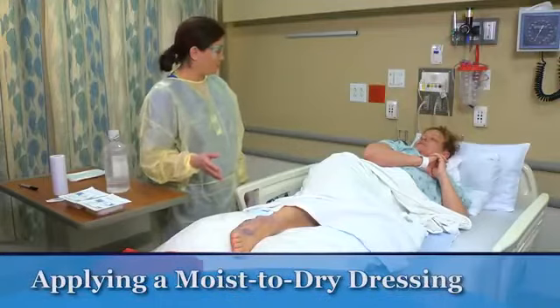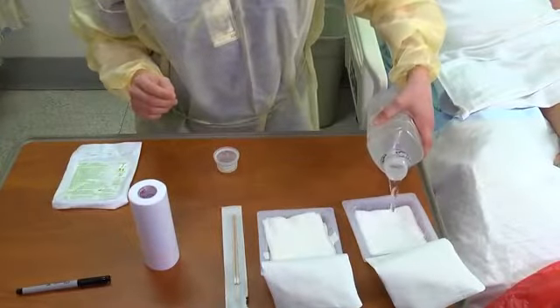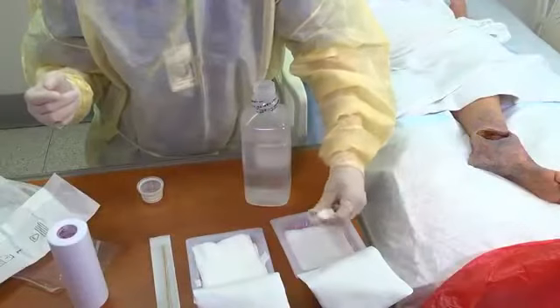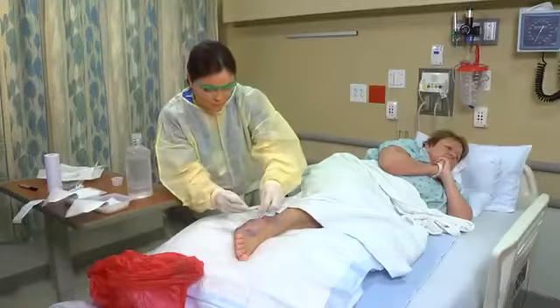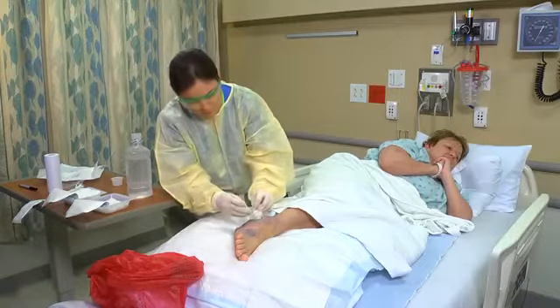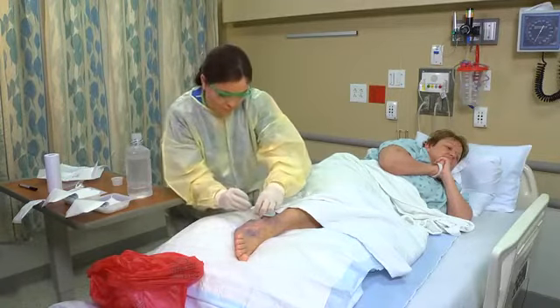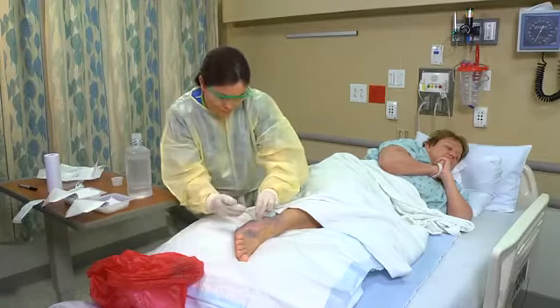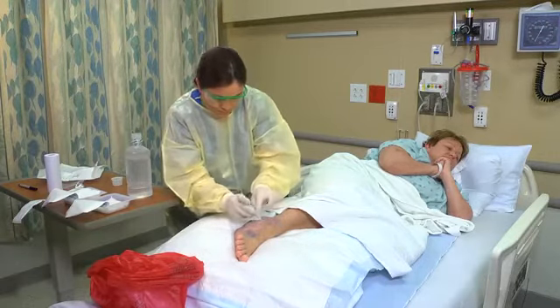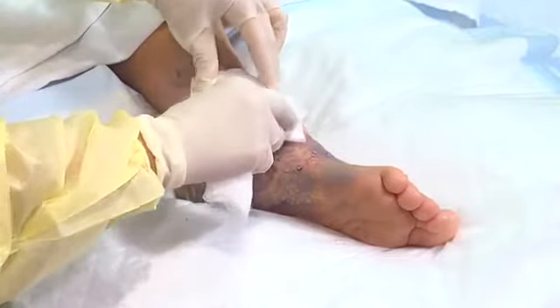To apply a moist-to-dry dressing, open a sterile package of fine mesh or loose 4x4 inch gauze and pour sterile solution over the gauze. Apply sterile gloves. Wring out the excess solution and apply the moistened fine mesh, open-weave gauze in a single layer directly onto the wound surface. If the wound is deep, gently pack it with gauze using your sterile gloved hand, forceps, or a cotton-tipped applicator until all wound surfaces are in contact with the moistened gauze. Be careful not to pack it too tightly and make sure the gauze doesn't touch the skin around the wound. Observe the packing to ensure that no dead space from sinus tracts, undermining, or tunneling remains. Then apply a dry sterile gauze pad over the wet gauze.